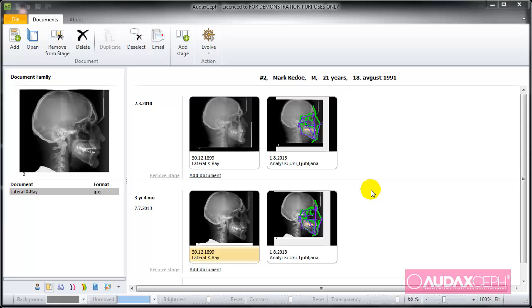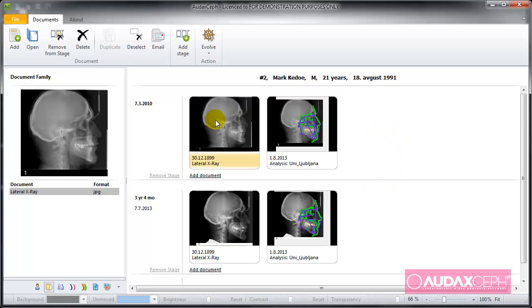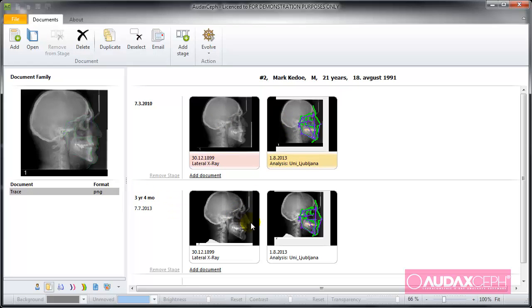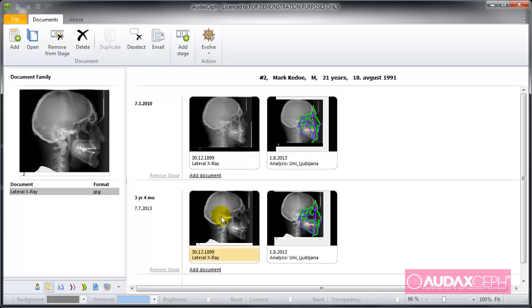Three options are available if you want to create a superimposition of two or more analyses. I have a lateral x-ray here and I have an analysis here. And later, three years and four months later, I have a lateral x-ray here and analysis here.